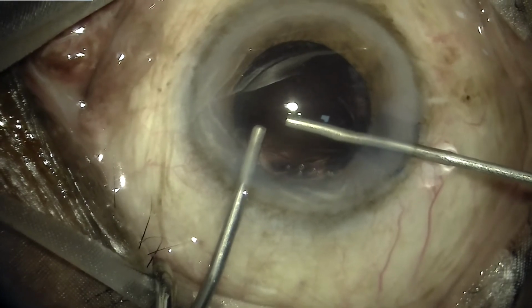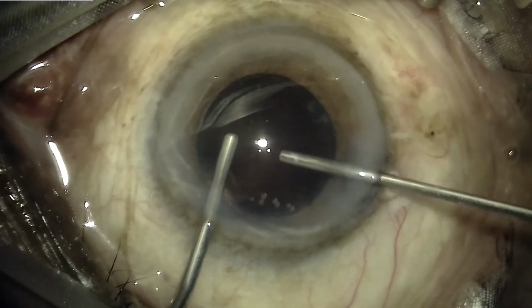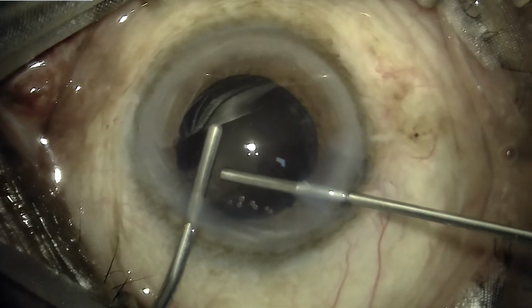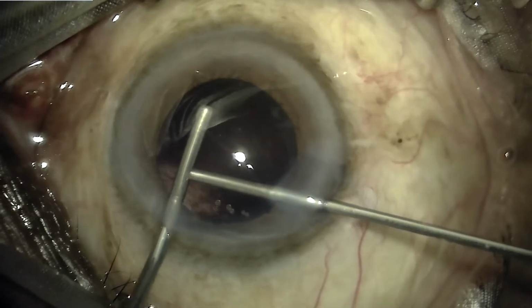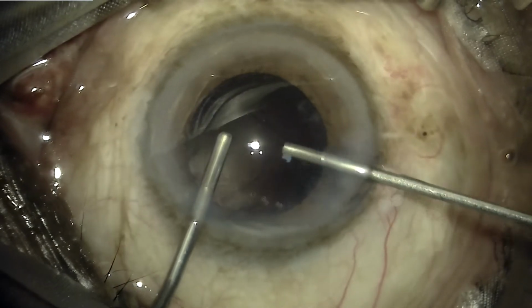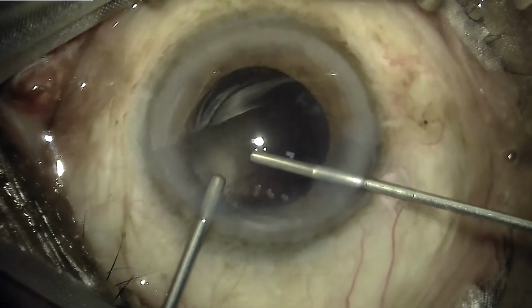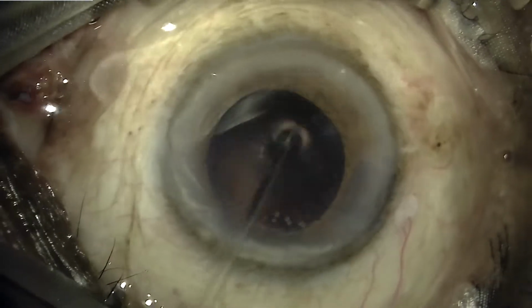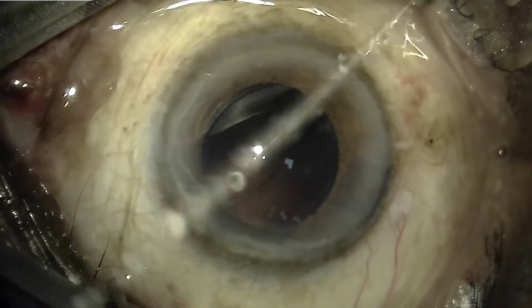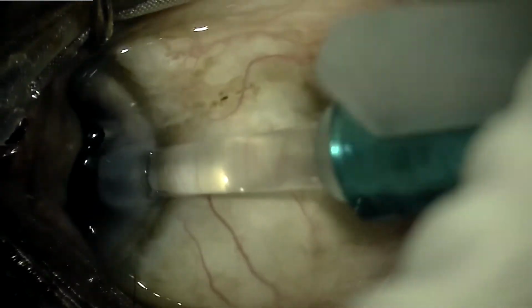And once we cut off the vitreous which is prolapsing into the wound, we can see the PC tear now appears much smaller. And this is the correct way. This is how a vitrectomy should be done. First of all, dry vitrectomy once you have vitreous in control, then irrigation and simultaneous vitreous removal. Once adequate clearance of the vitreous has been done from the anterior chamber, we can proceed to implant the IOL.